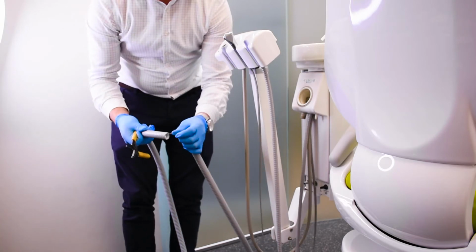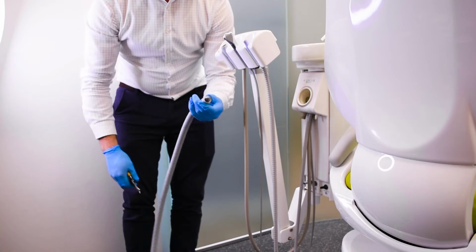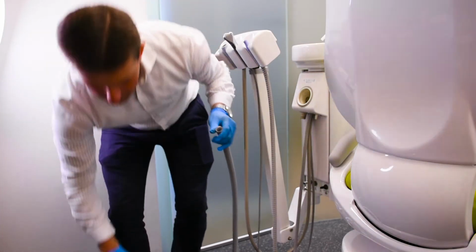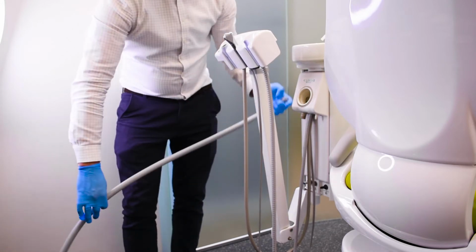Occasionally it leaves a little nylon spiral attached, so just use some scissors to cut that off. Once that's done, we need to re-glue this end onto the spittoon.